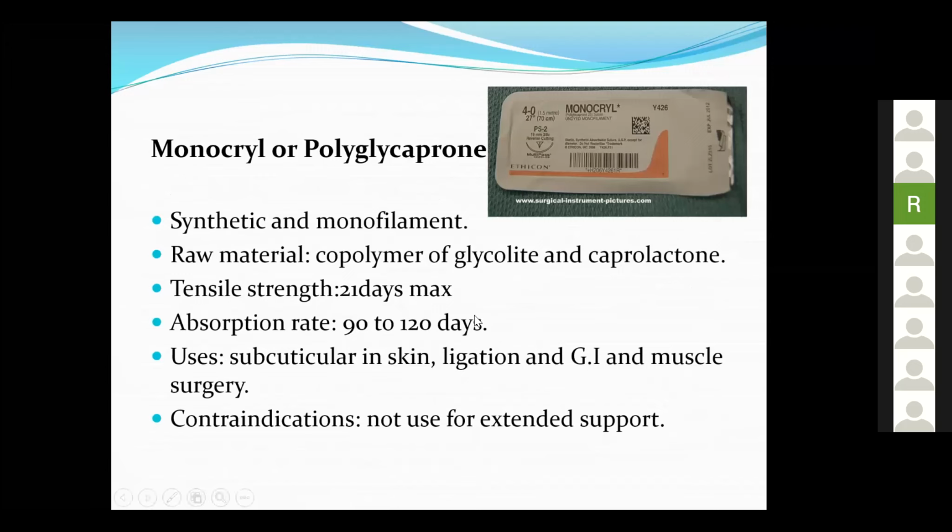Monocryl is synthetic, like Dexon and Vicryl, but Monocryl is monofilament. Monofilament sutures glide through the tissues very easily, while multifilament glides through tissue with difficulty. On the other hand, whatever glides through easily makes it difficult to secure a good knot. If you are tying a knot with a single hair-like strand, it will be very difficult.